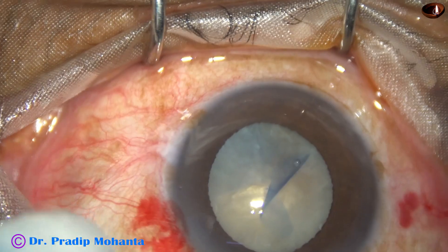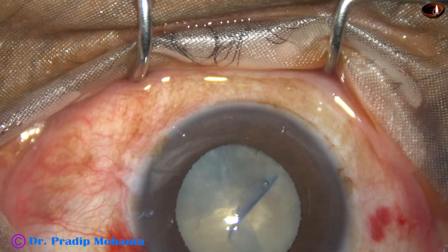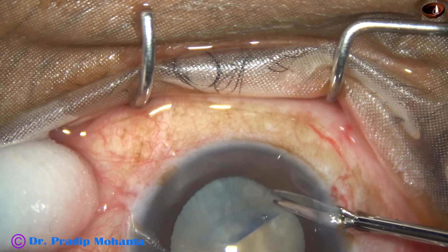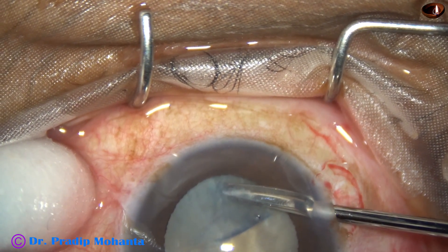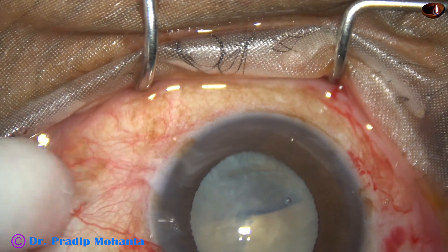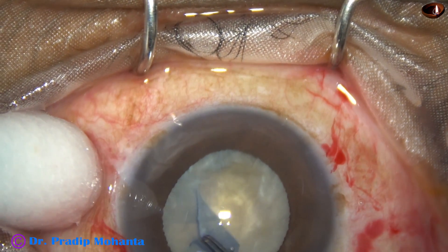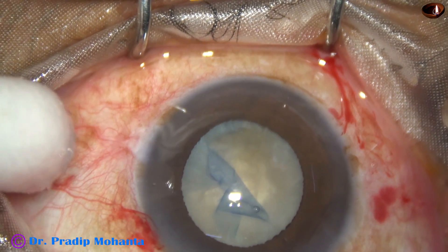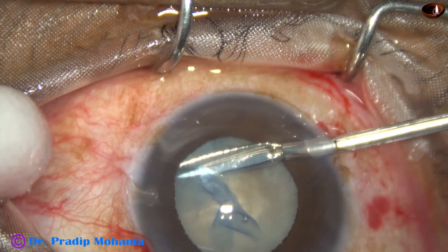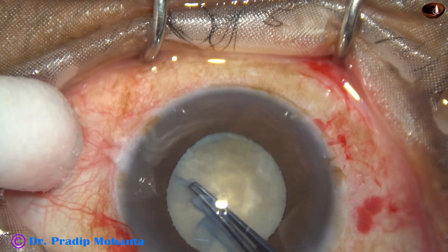So what to do now? I make a side port at 7 o'clock. I take a vitreous micro scissor and cut the capsule along with the fibrous band underneath. I thought this much cutting was fine, but trying again with the utrata it is still attached to the underlying fibrous band. So I go again into the anterior chamber with the scissor and cut a little more, and now I can complete the rhexis.